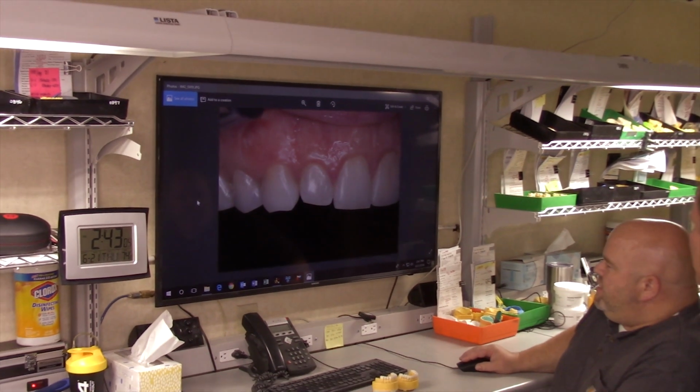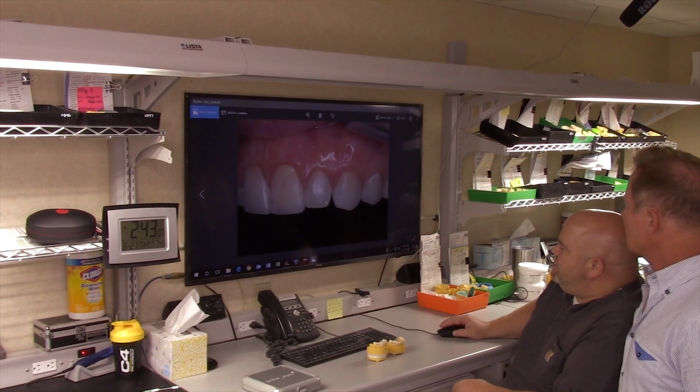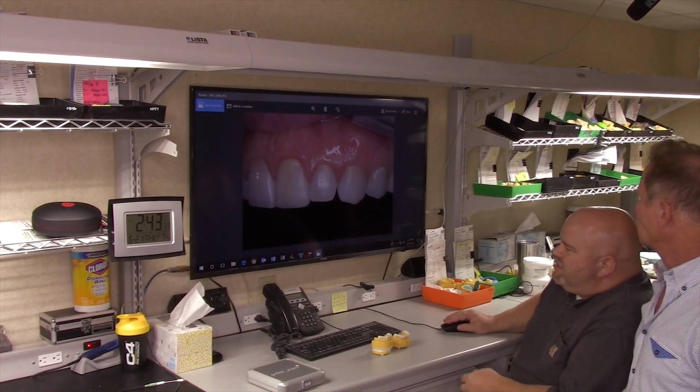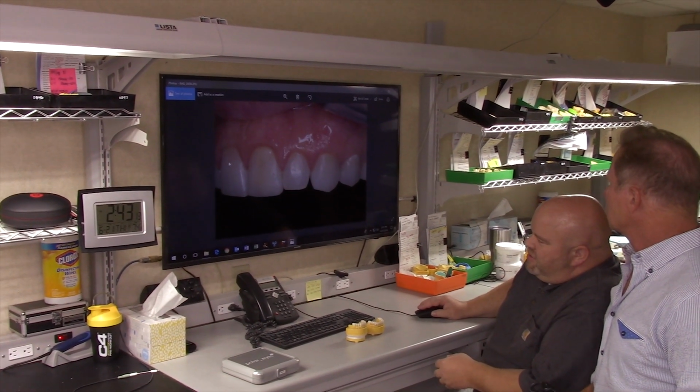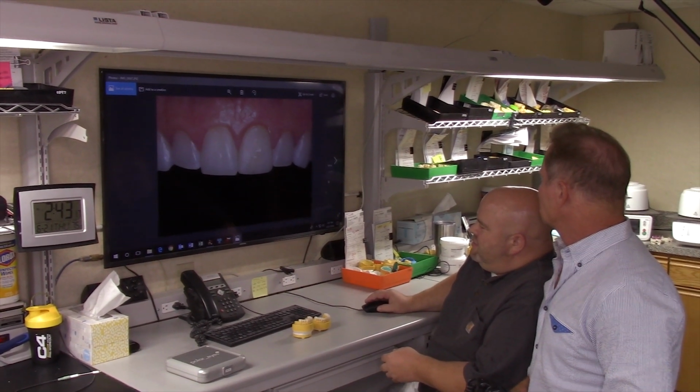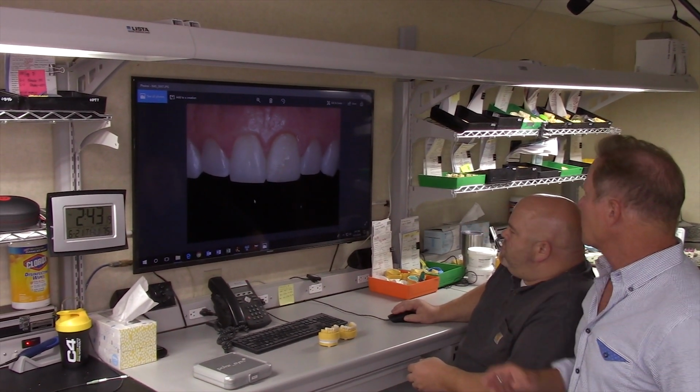Yeah, they look very different in different light, different angles. The way the flash hits it changes the overall appearance a lot. We can see a lot of the craze lines and different characterizations with this angle that we can't see in the head-on angles. So go back to that next one, Phil.